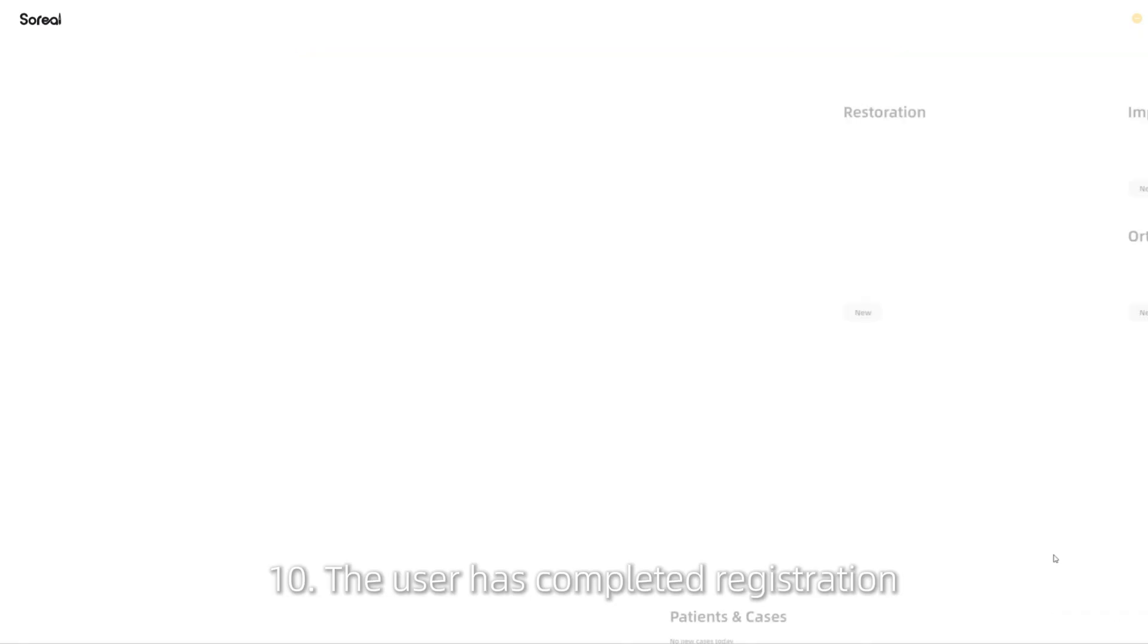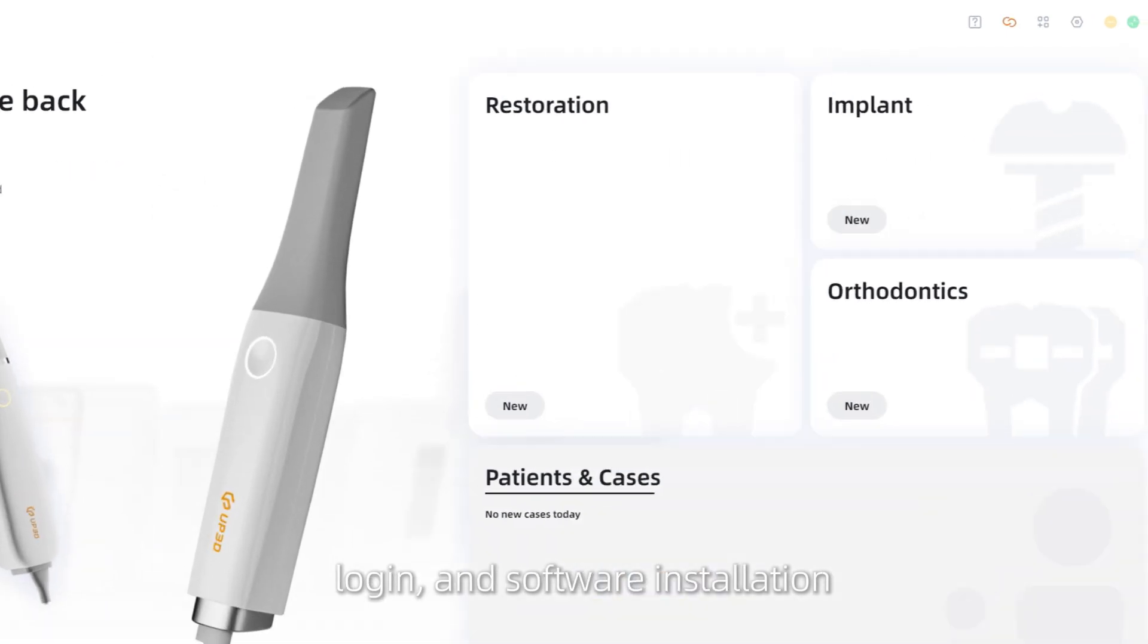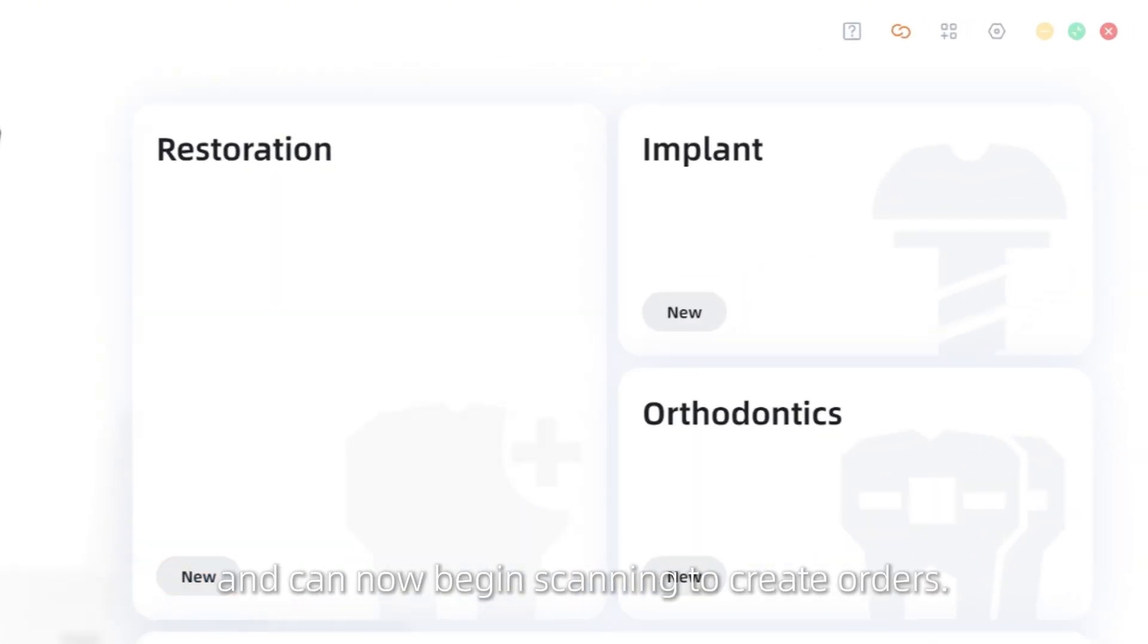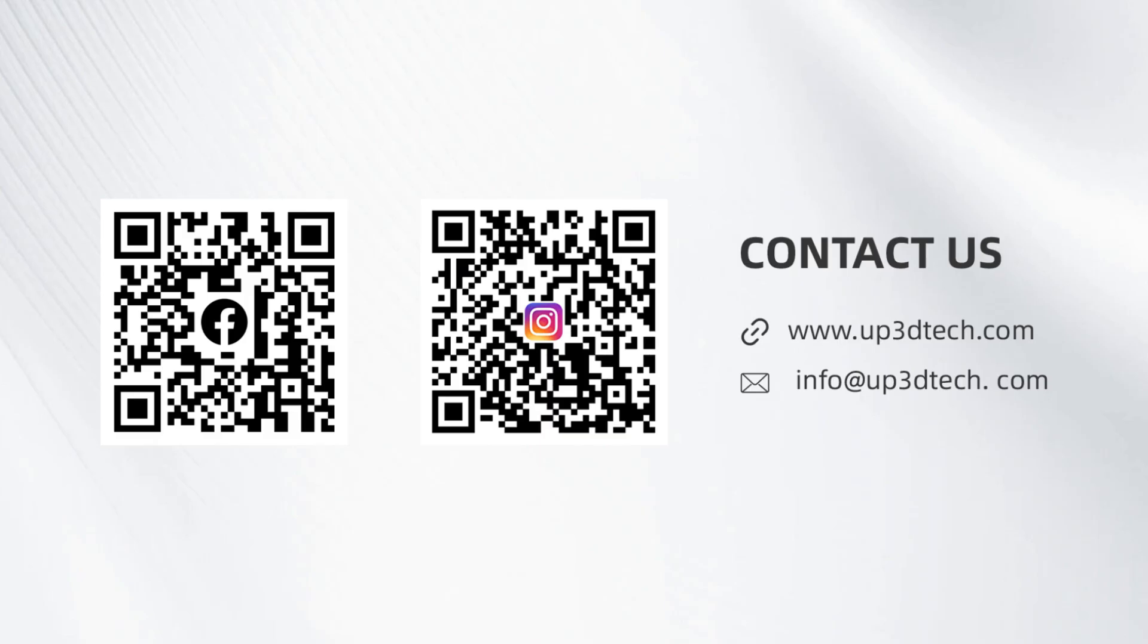The user has completed registration, login, and software installation, and can now begin scanning to create orders. That's all for this video.